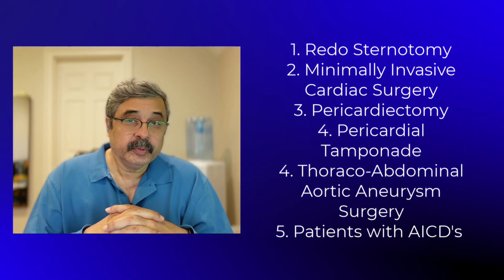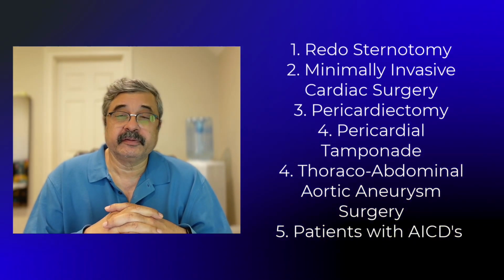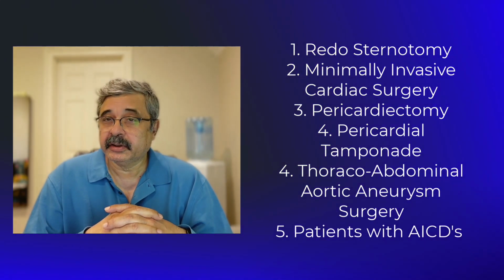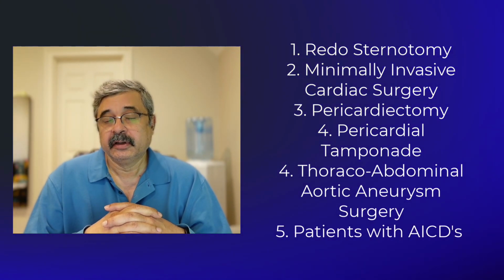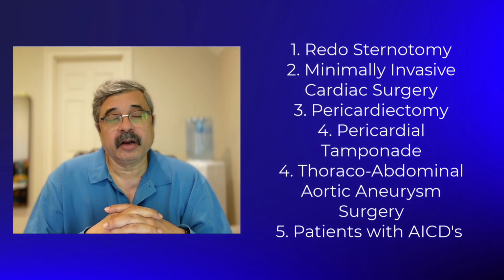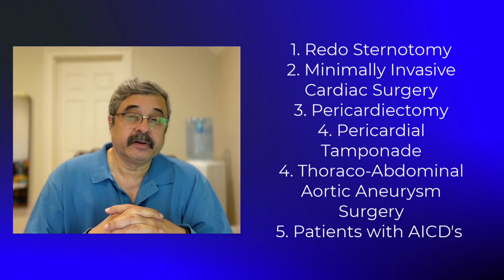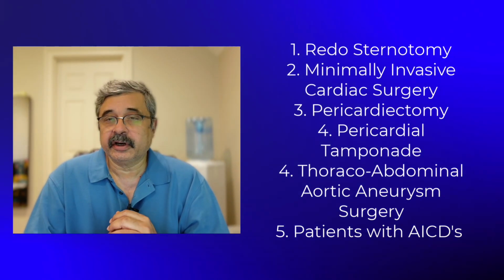R2 pads can be applied to any patient who has a high risk of arrhythmia requiring cardioversion or defibrillation before, during, and after induction, but there are certain absolute indications for these transcutaneous pads. The first and foremost is redo cardiac surgery or redo sternotomy for any reason. This is because there's limited access to the heart, and during dissection in and around the heart, if there's an arrhythmia, there is limited access to the sides of the heart for application of internal cardioversion paddles.